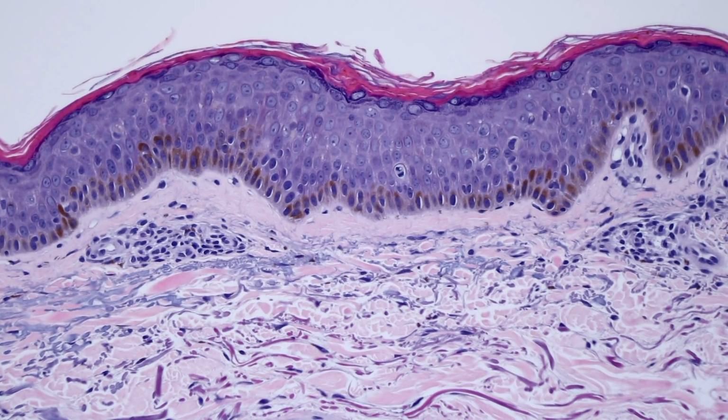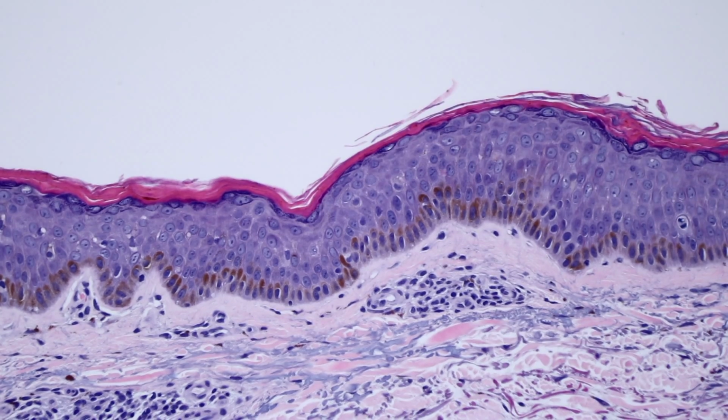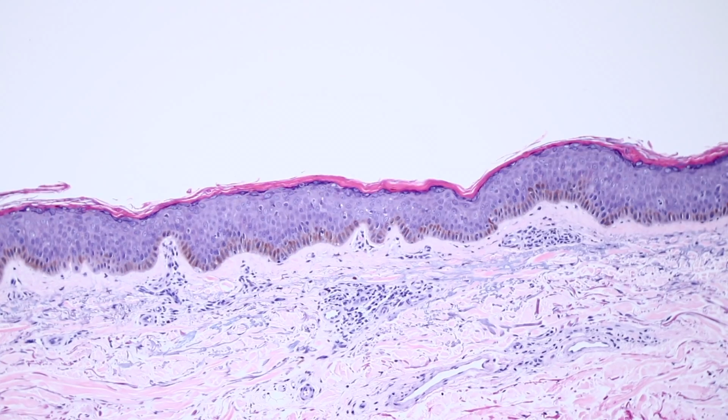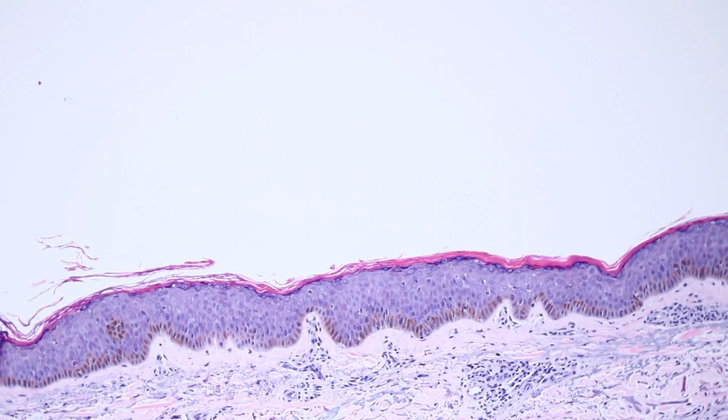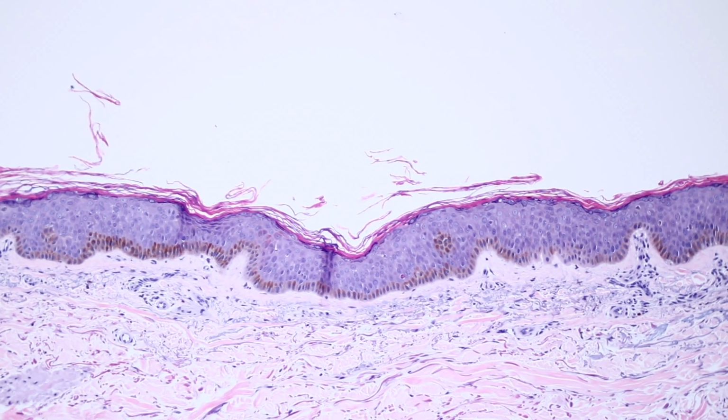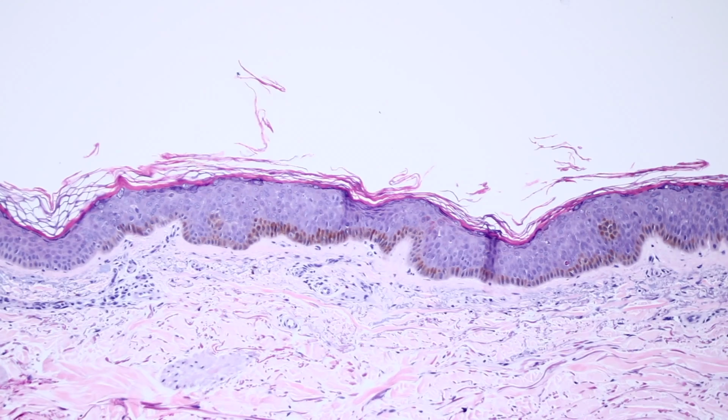So I see this on a regular basis, and it may be that some of these are HPV related, probably not sexually transmitted, just because HPV is very prevalent in our environment, and it's all over everyone's skin probably, and there are so many different types of it. So I suspect that there are some sun-related squames that also may have some HPV-derived origin, because I see things that look like the HPV HSIL type squam in situ.